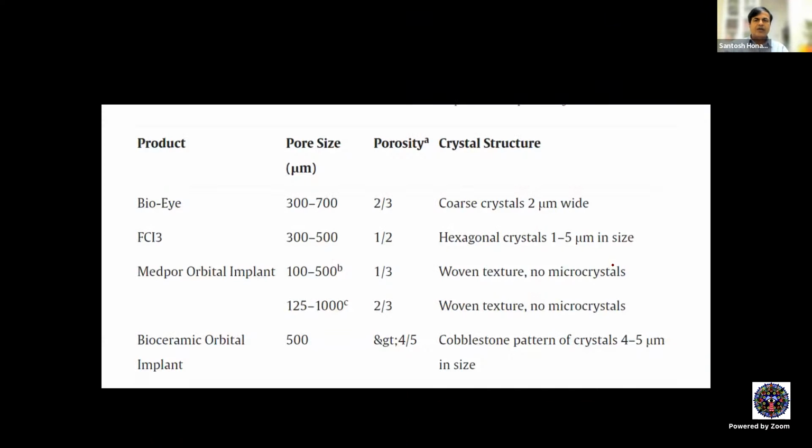Now, this is sometimes commonly asked, at least if not for a resident, this is a quiz question that fellows are often asked: what is the pore size? What is the ideal pore size? If you're choosing an implant, for example, if you go to a conference or an exhibition, you'll find a lot of implants. But if you ask the manufacturer what the pore size of their implant is, they will not know, or they're not bothered. They're just there to sell the implant without realizing that there has to be a particular pore size for ideal integration.